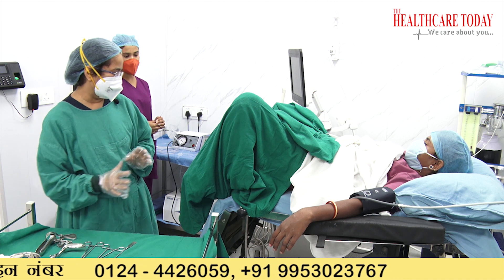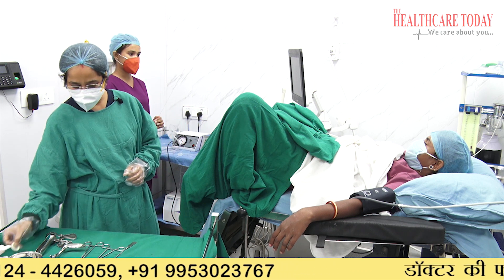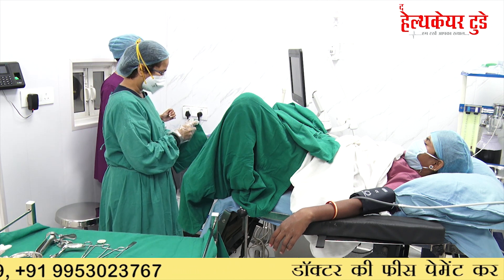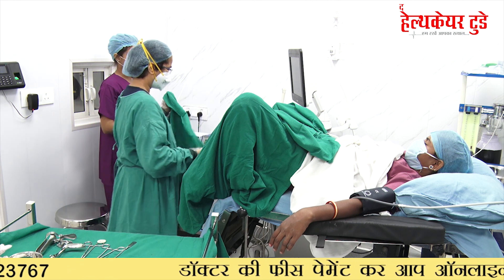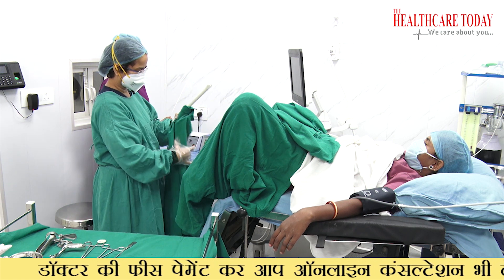The patient is covered with a green sterile sheet. Then the machine has to be prepared — the ultrasound probe has to be covered by a sterile sheet. The probe on which you are going to do the procedure must be covered by the sterile sheet.